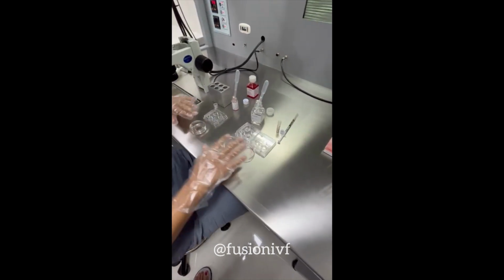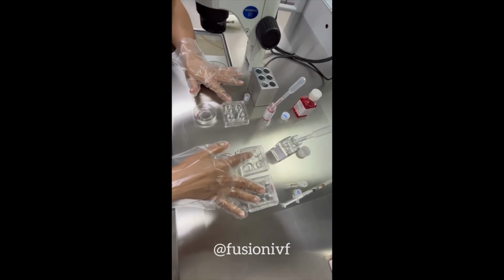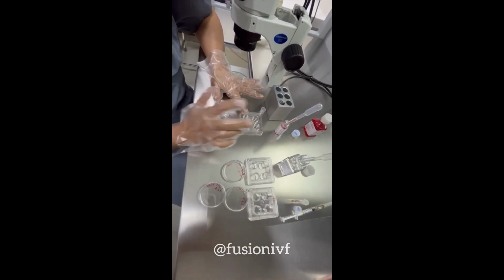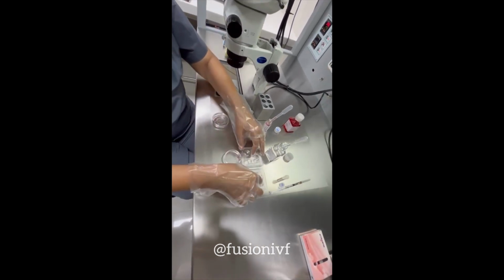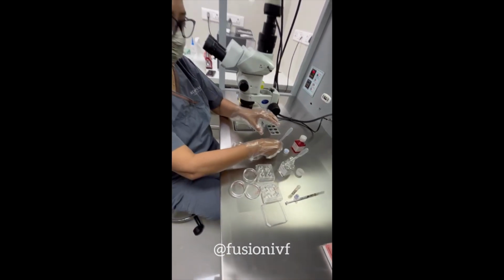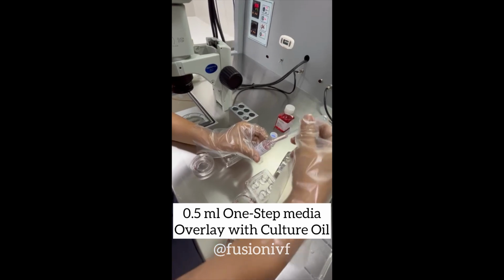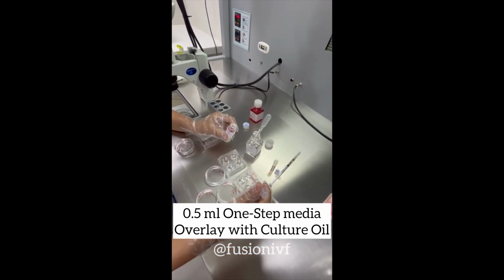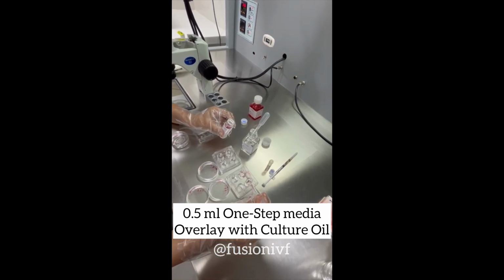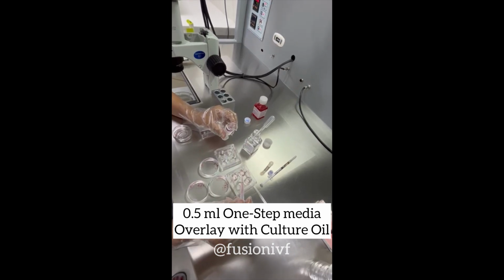And here, these are the culture plates. This is for one patient, 5 to 6 embryos, and this is for other patients. So I'll be making culture plates. This is the one step media. I'll be putting 0.5 of the one step in each drop. Two drops in the center.